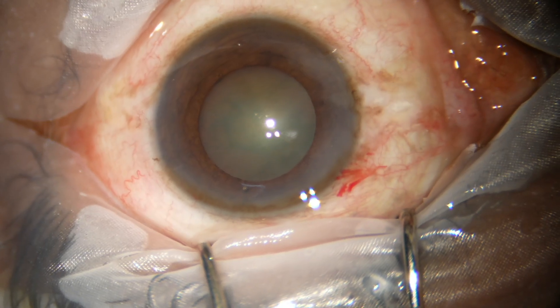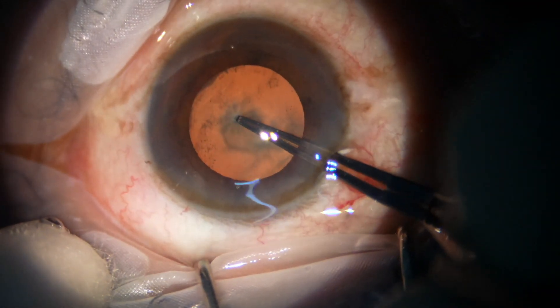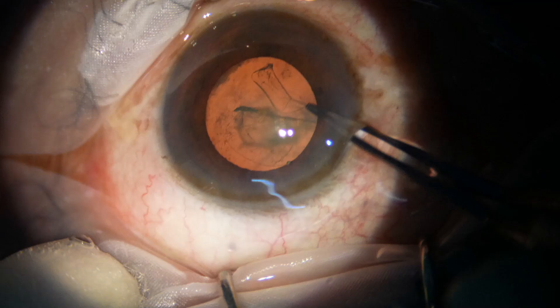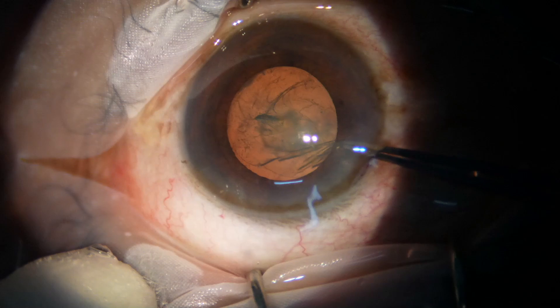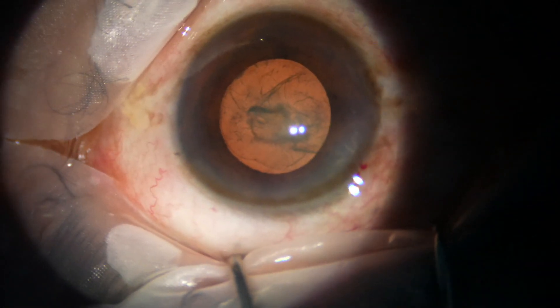The main incision has been made and a side port has been made on the left side of the main incision, about 90 degrees away. Now I go to stereo coaxial illumination of the Lumera T microscope and do the capsulorhexis. This is an adequately sized capsulorhexis.